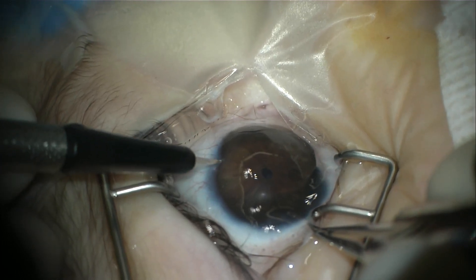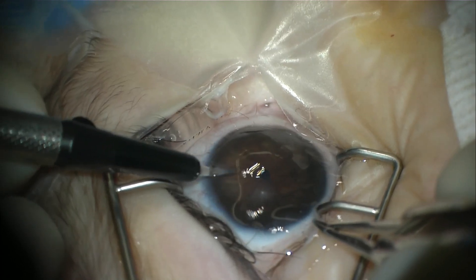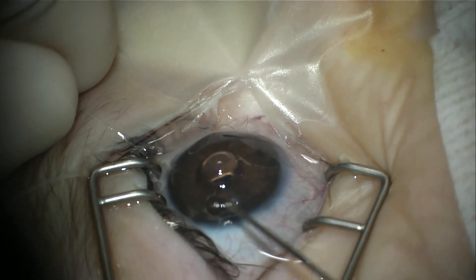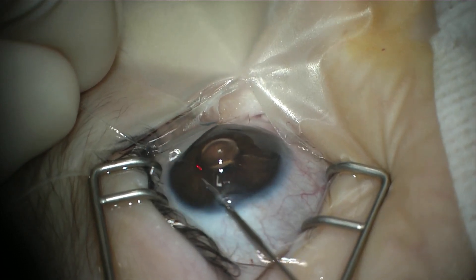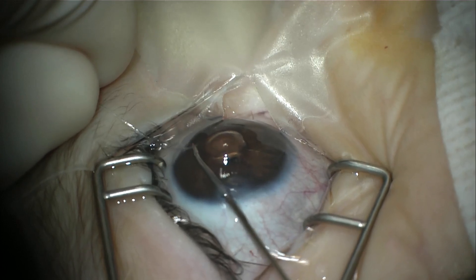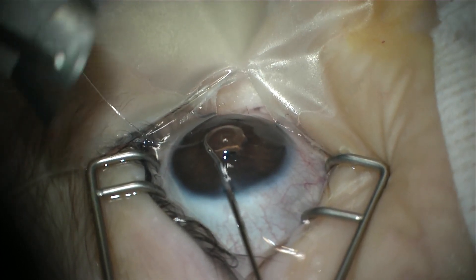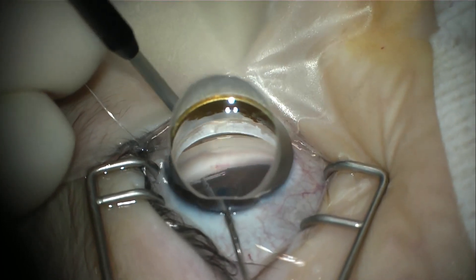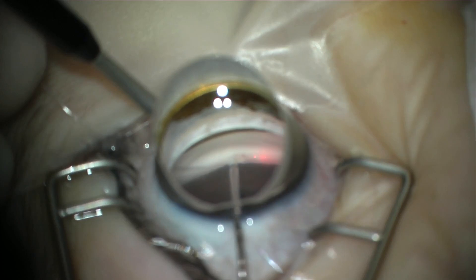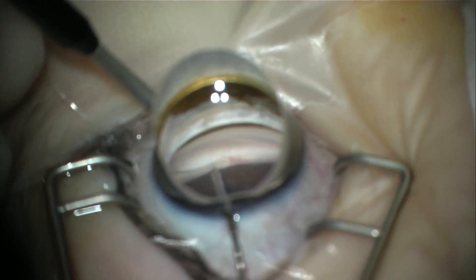To do that, we orient our catheter so that it's approaching from the opposite side, so a new paracentesis is made. Now we will re-insert our catheter — the microforceps grasps the tip of the catheter, the gonio lens goes back into place, and the microcatheter is inserted through the same incision, back into Schlem's canal, but this time going in the opposite direction.